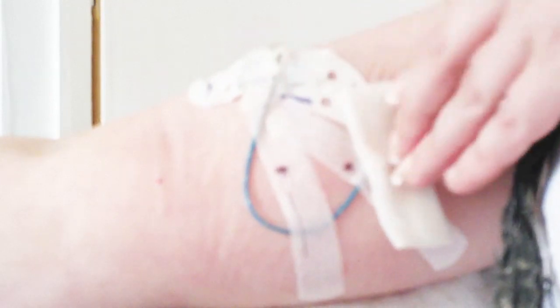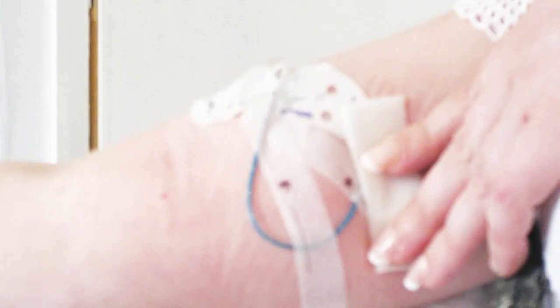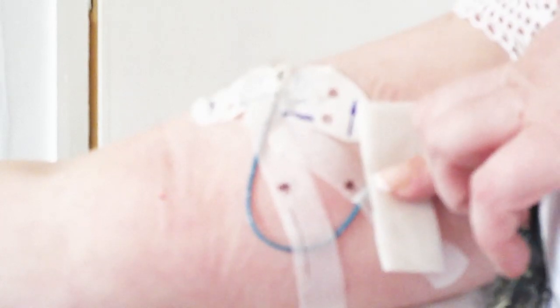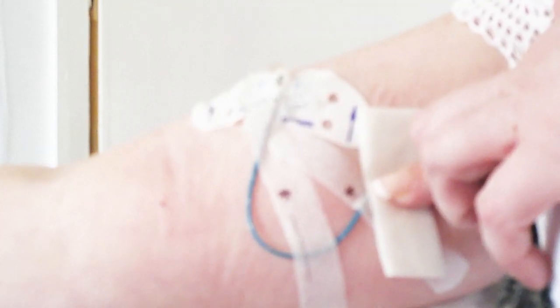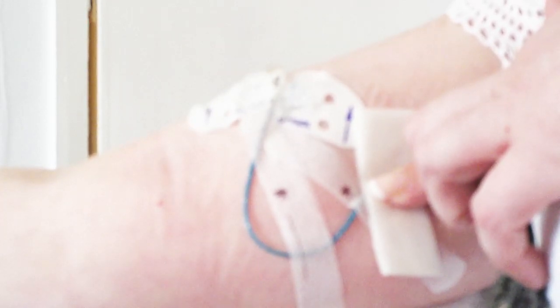So if I wear gloves when I do this, what actually happens is the glove, when I'm trying to hold here while I pull off the dressing, has actually stuck to the line, and then as I've moved my finger away, the line's coming with it, so I've pulled some of the line out. Not on this one, but a previous line that I had. This line does have a lot out. There's also a lot in because it sits in the vena cava in your heart, at the entrance of your heart. But there is a lot out and a lot in.